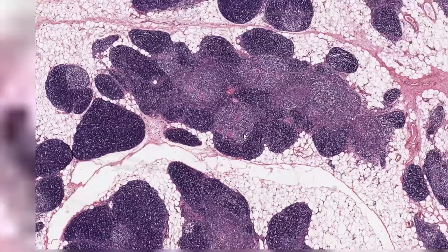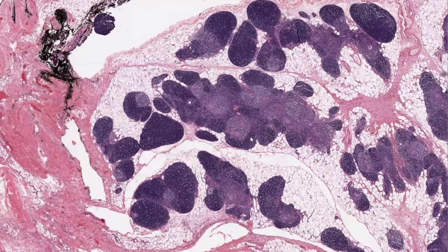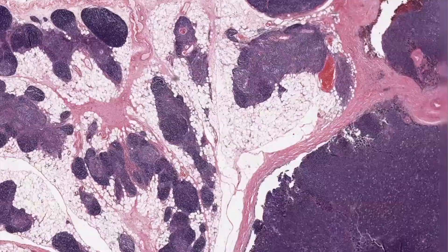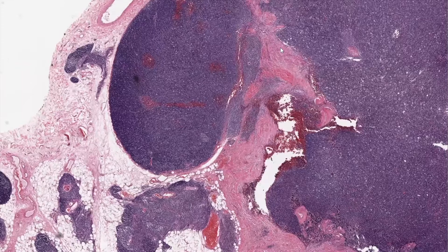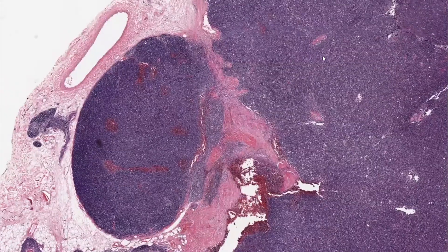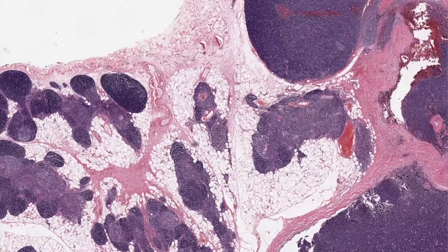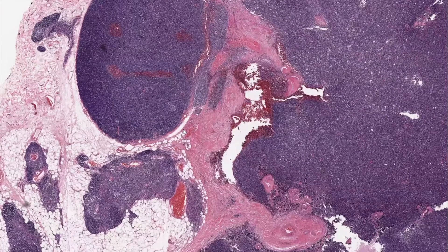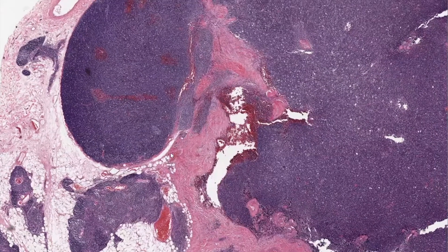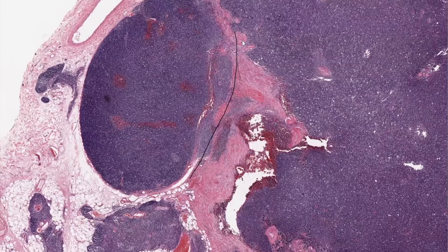This is our normal thymic parenchyma and you notice there's not really any thick dissecting fibrous bands. However, when we go over here we start to see these thick dissecting fibrous bands throughout the tissue. This is what you see in a thymoma — this allows you to distinguish the normal architecture without thick fibrous bands from areas where we start to see these thick intersecting fibrous bands throughout the tissue, which is characteristic of a thymoma.